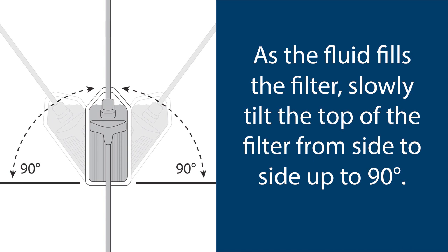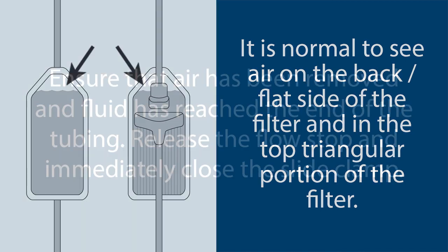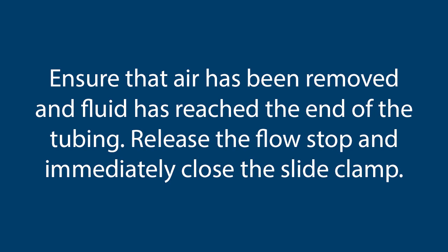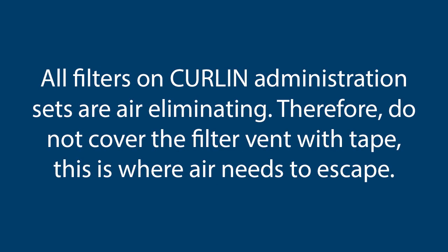Tap the filter housing to release air bubbles. Return the filter to an upright position and continue priming until air has been removed from the ribbed section of the filter and the full length of the tubing. Note: it is normal to see air on the back/flat side of the filter and in the top triangular portion of the filter. Ensure that air has been removed and fluid has reached the end of the tubing. Release the flow stop and immediately close the slide clamp. Once the slide clamp is closed, inspect the full length of the tubing again to ensure there is no air present. All filters on the Curlin administration sets are air eliminating; therefore, do not cover the filter vent with tape, as this is where the air needs to escape.